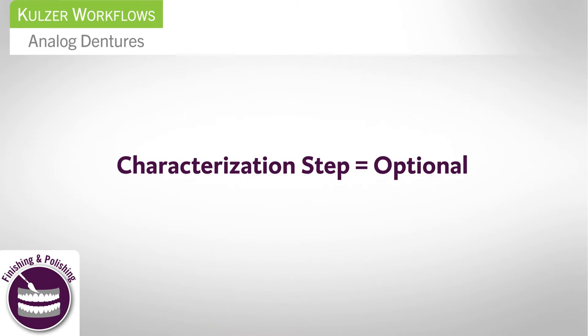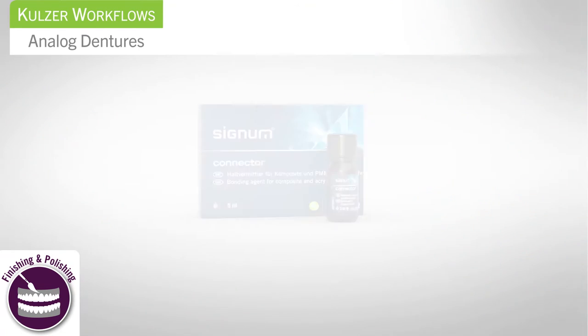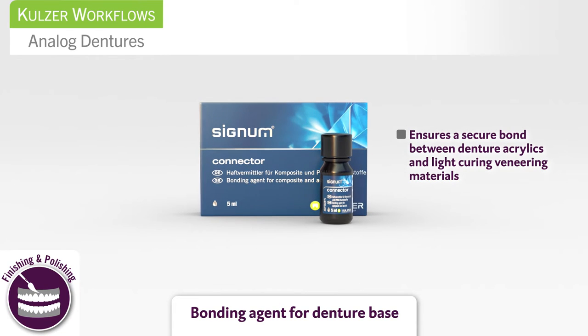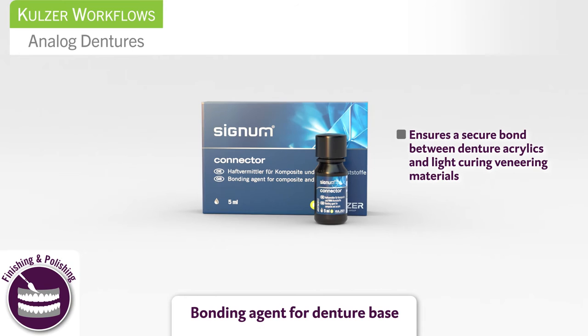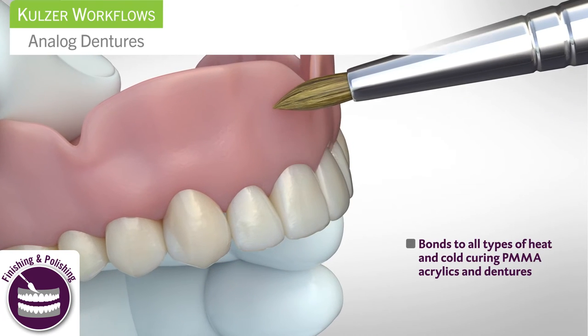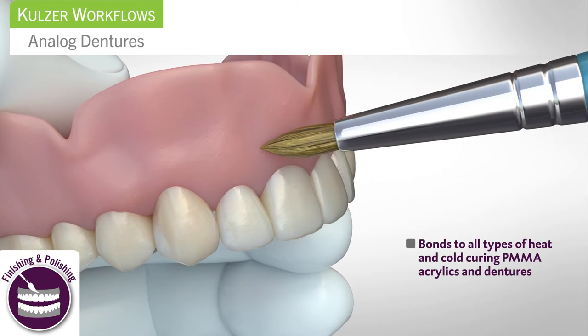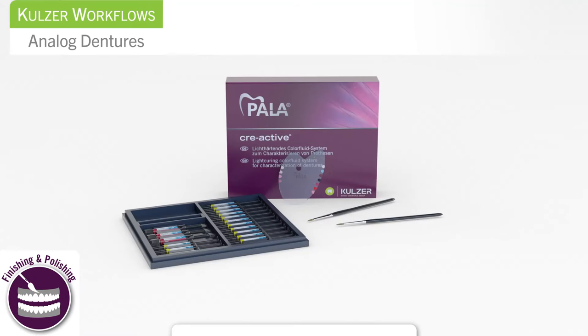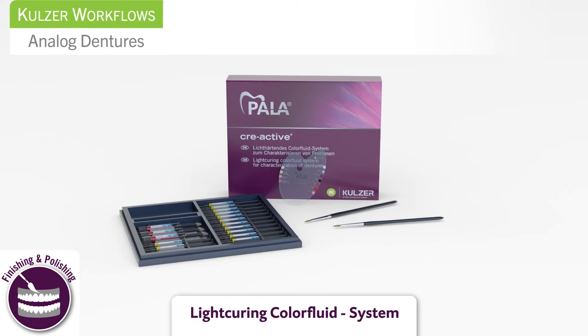For additional quality and aesthetics, characterize the denture by roughing the surface with a burr. Bonding Agent Signum Connector ensures a secure bond between denture acrylic and light curing veneering materials. Apply Signum Connector to the denture. This bonding agent bonds to all types of heat and cold curing PMMA acrylics.